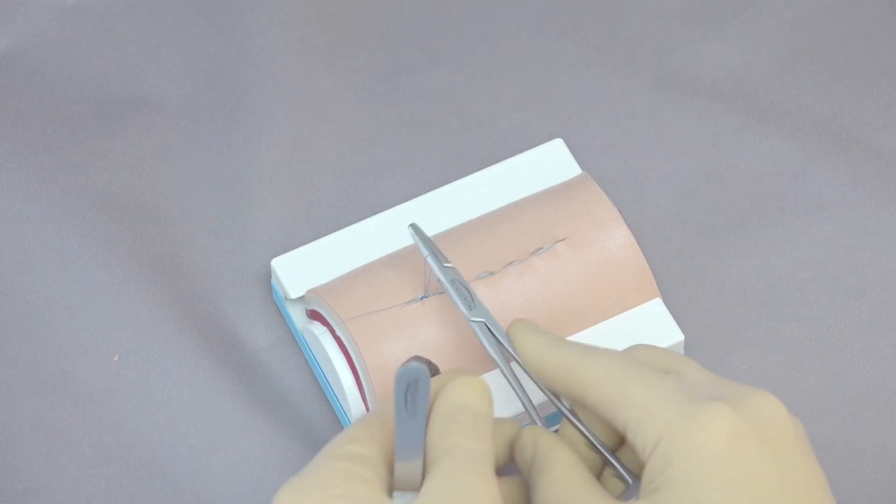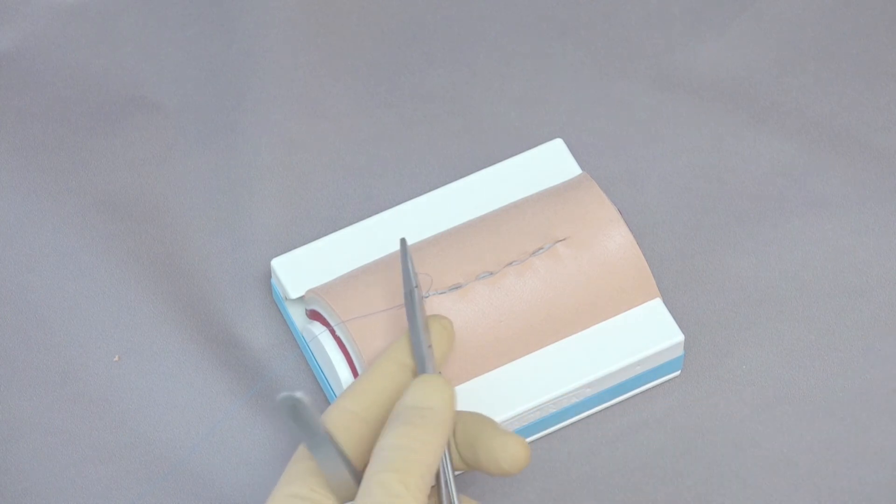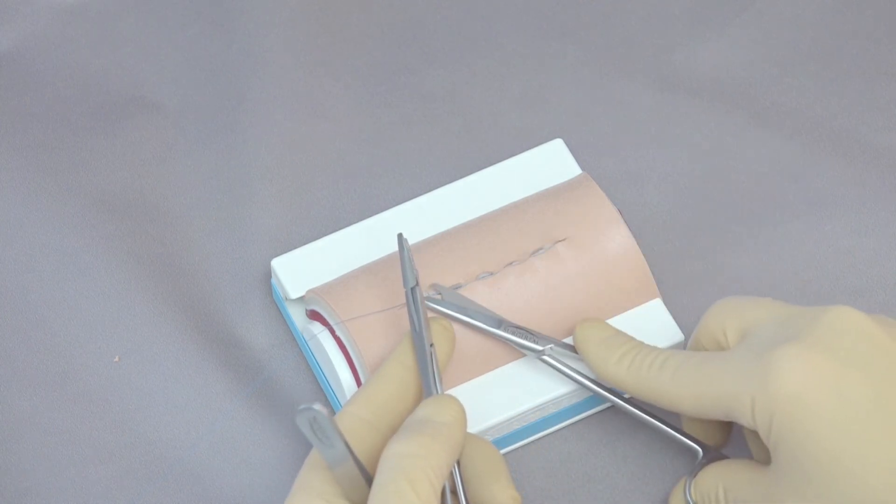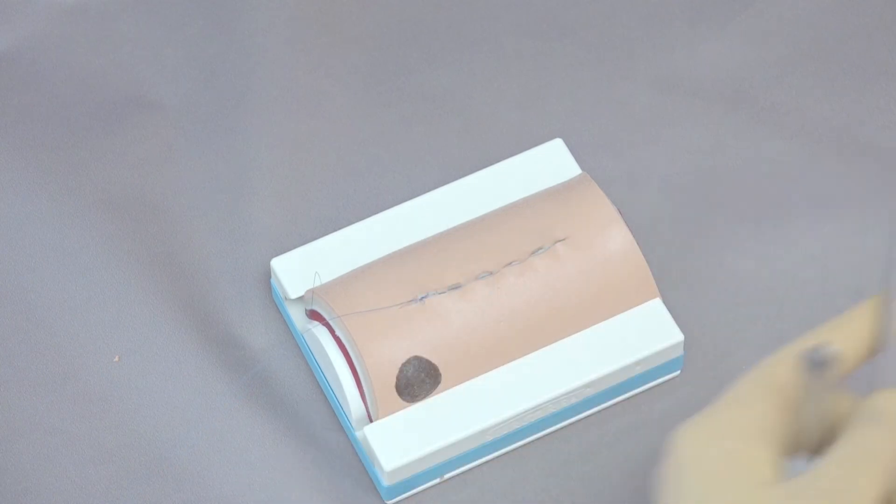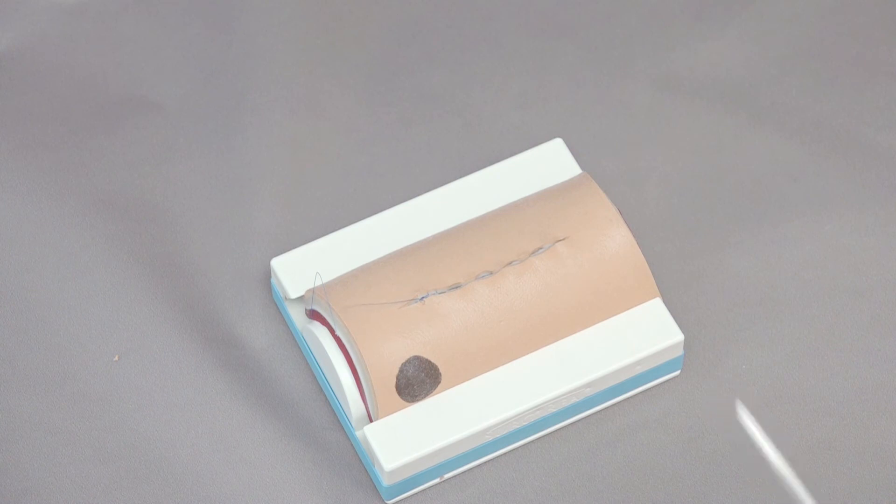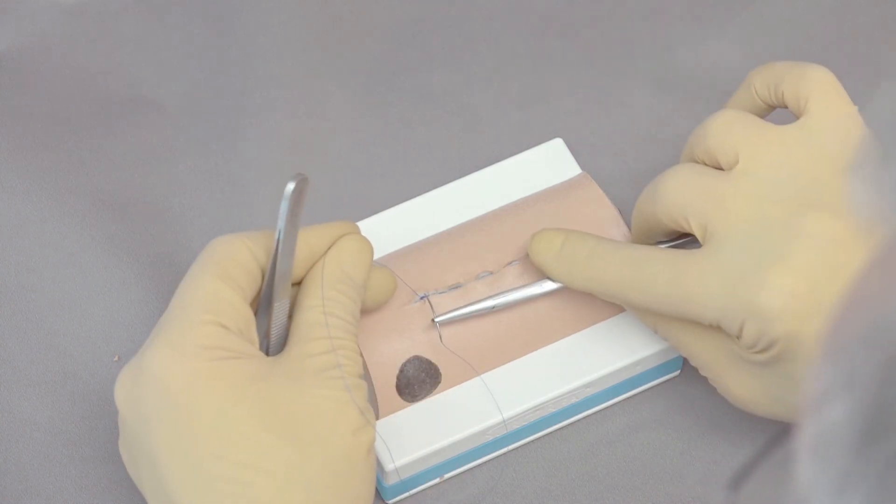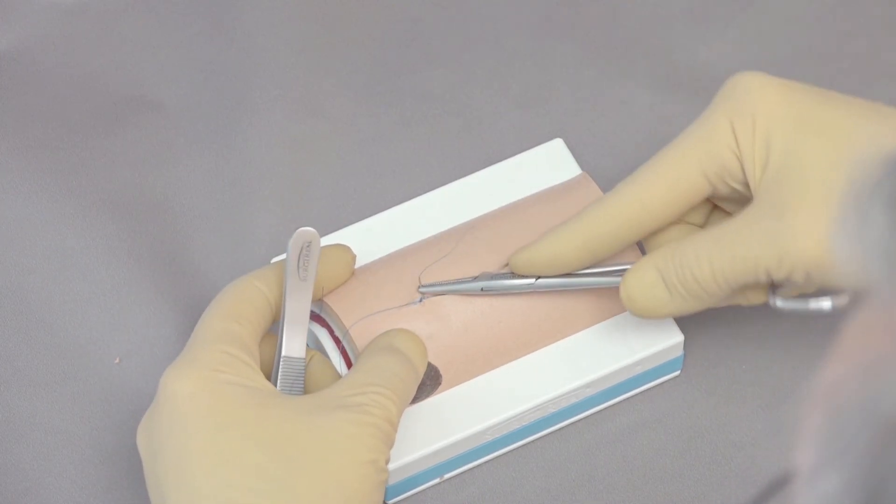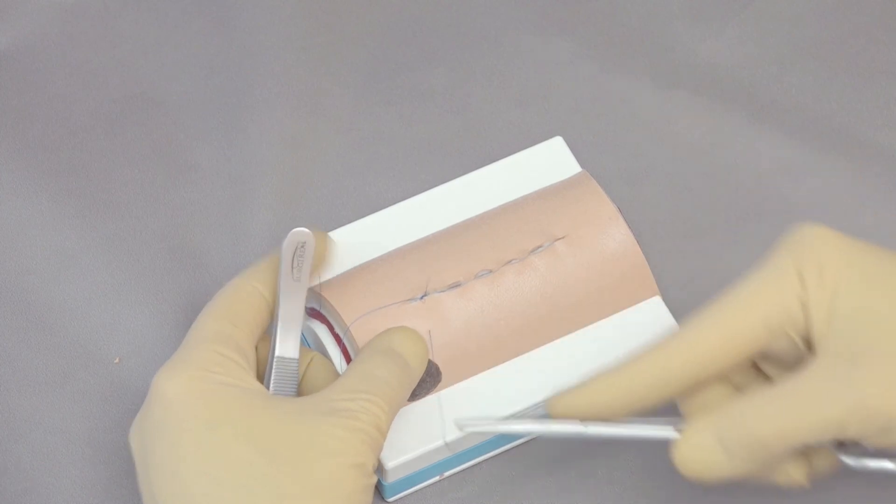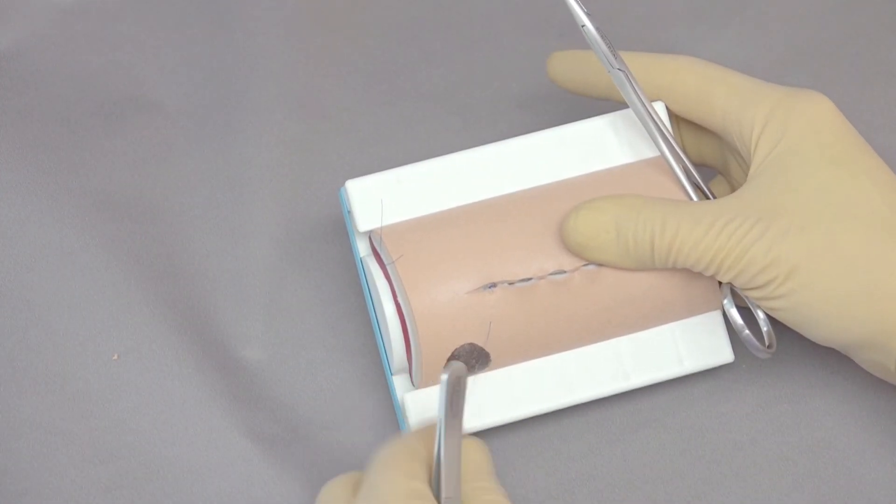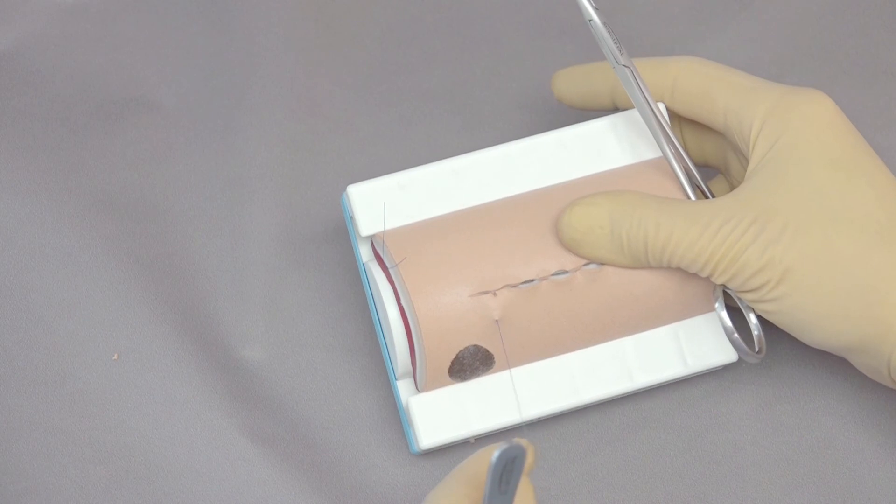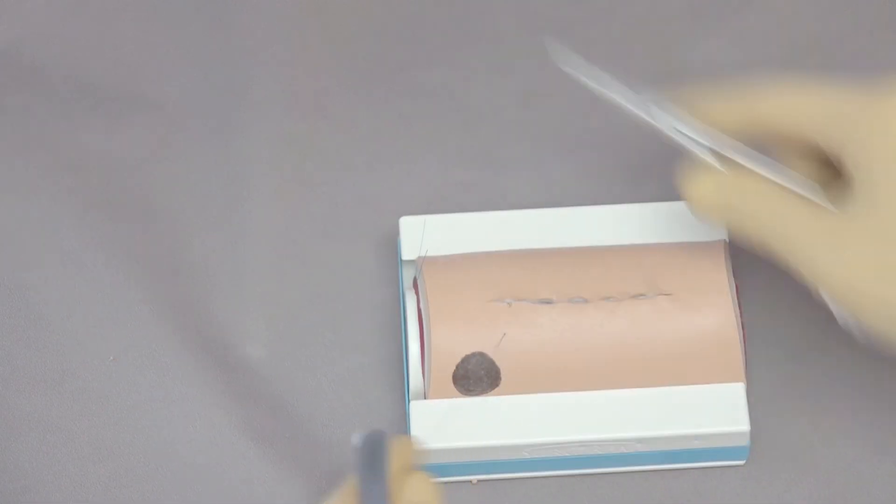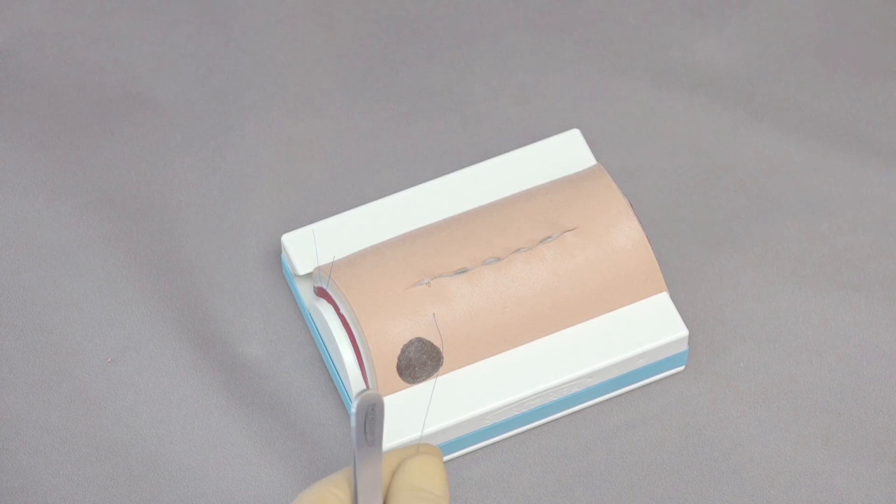Because we're going to bury, we're going to just cut the loop here. So it's important to just cut the loop two millimeters long. Then we can take the needle again, right down along the knot. And we're going to bring that through skin here to the side. And if you watch this now as we pull this down, that will pull the knot down into the depths of the incision itself. So now the knot is completely buried.